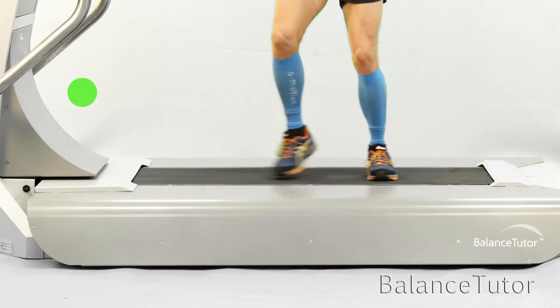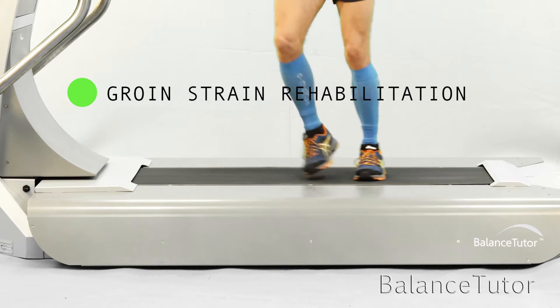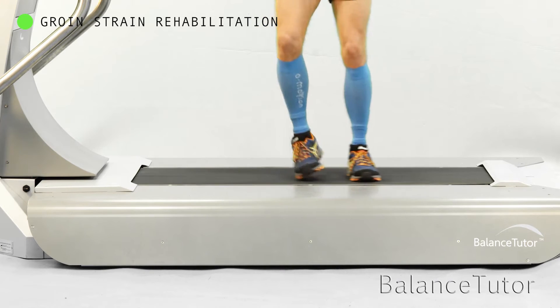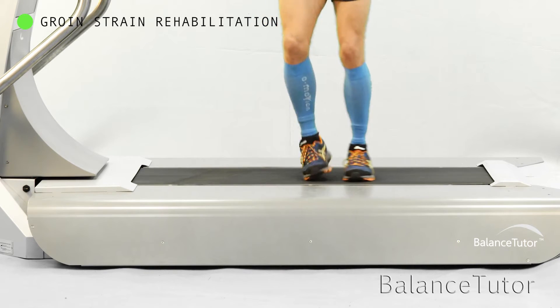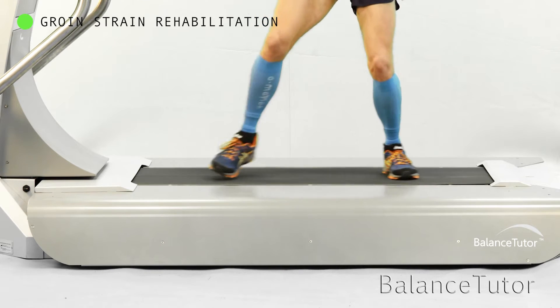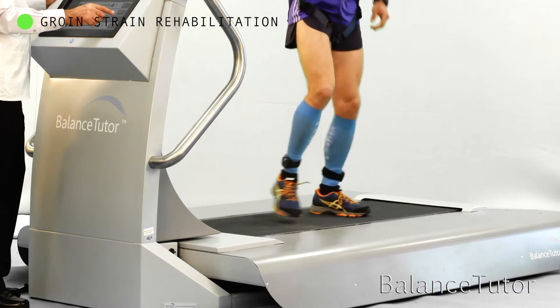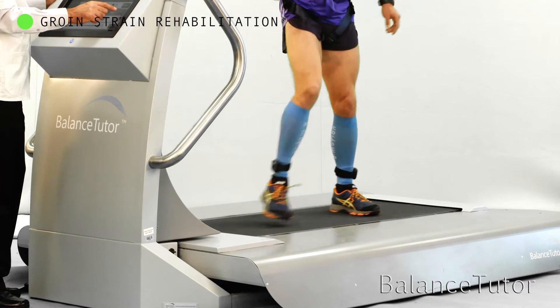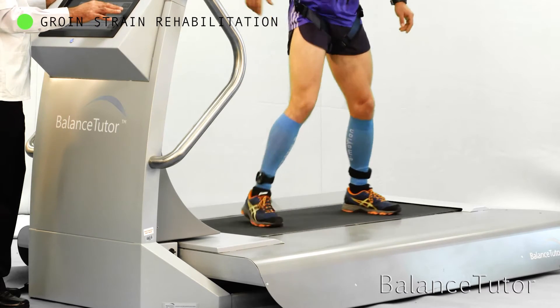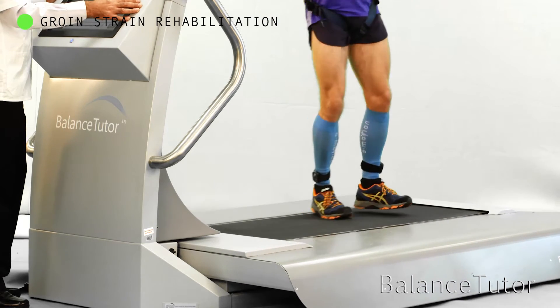This next treatment targets groin strain rehabilitation. Customized perturbation while walking sideways forces a fast change in stride length and challenges agonist and antagonist hip muscle coordination.